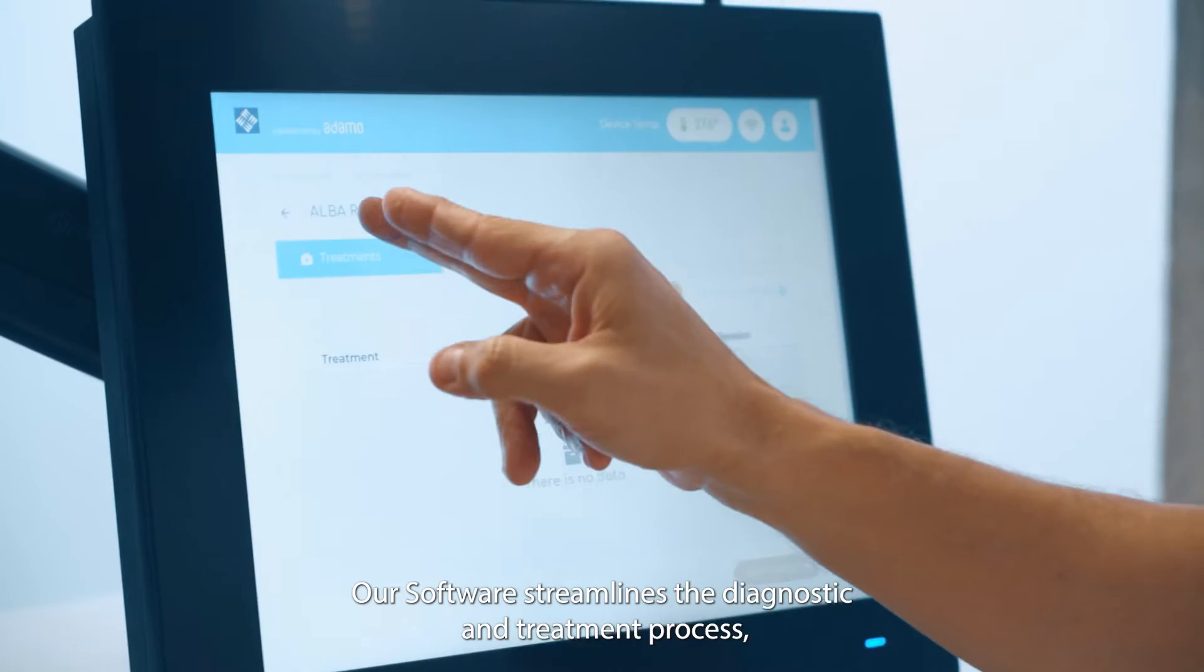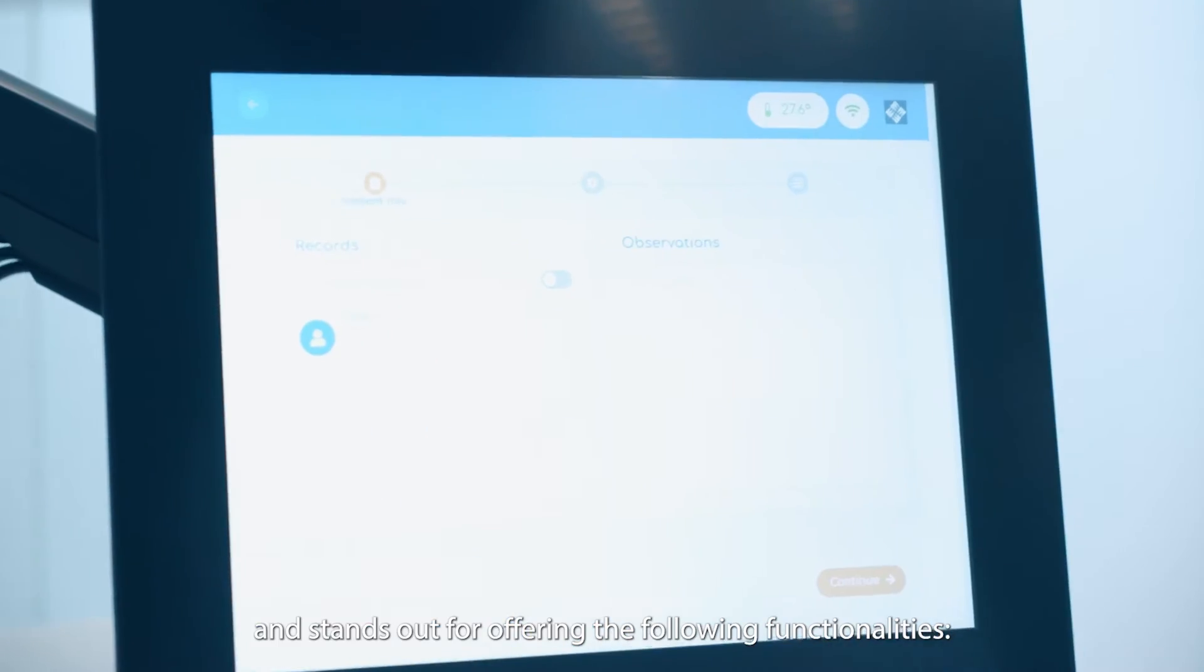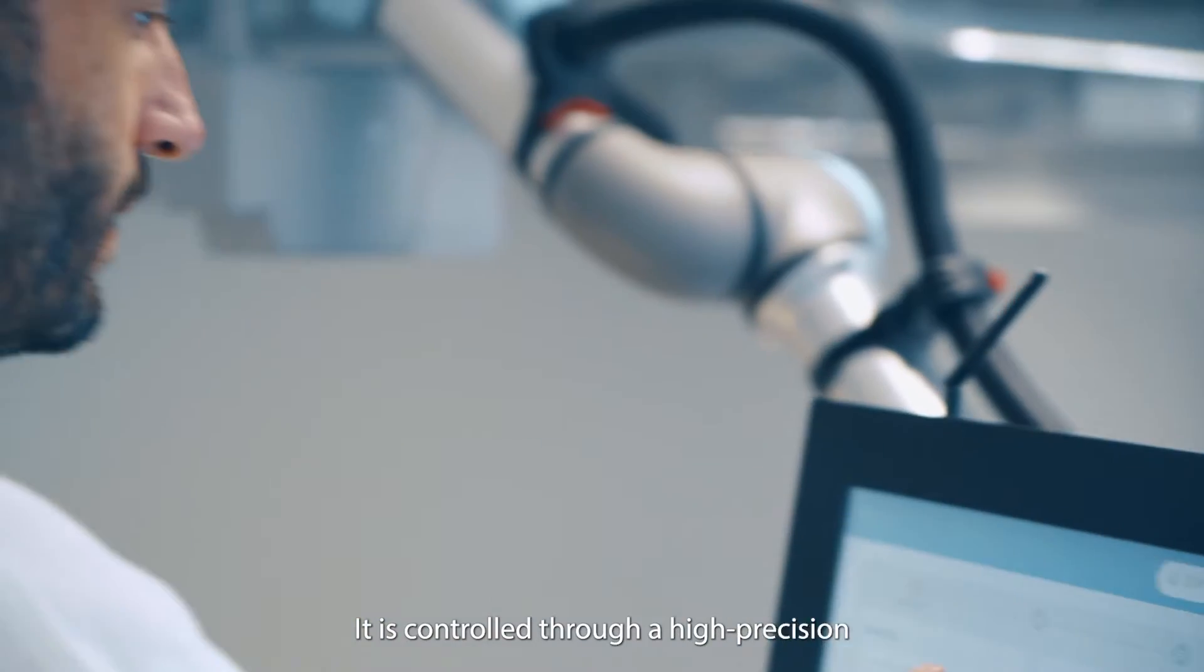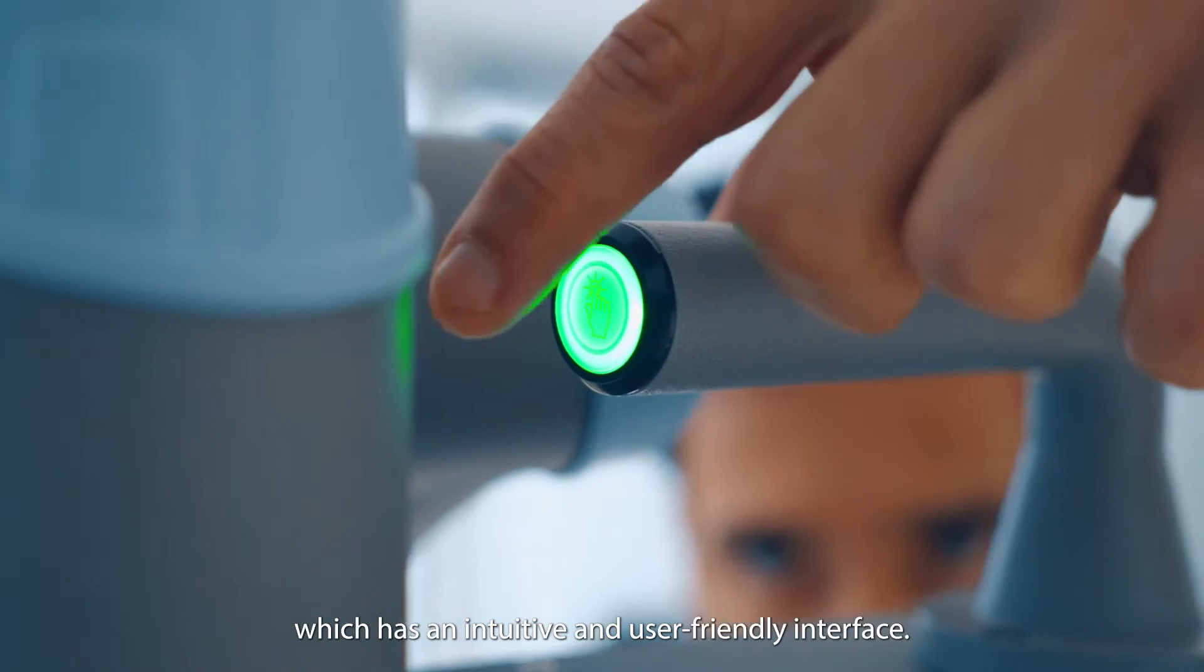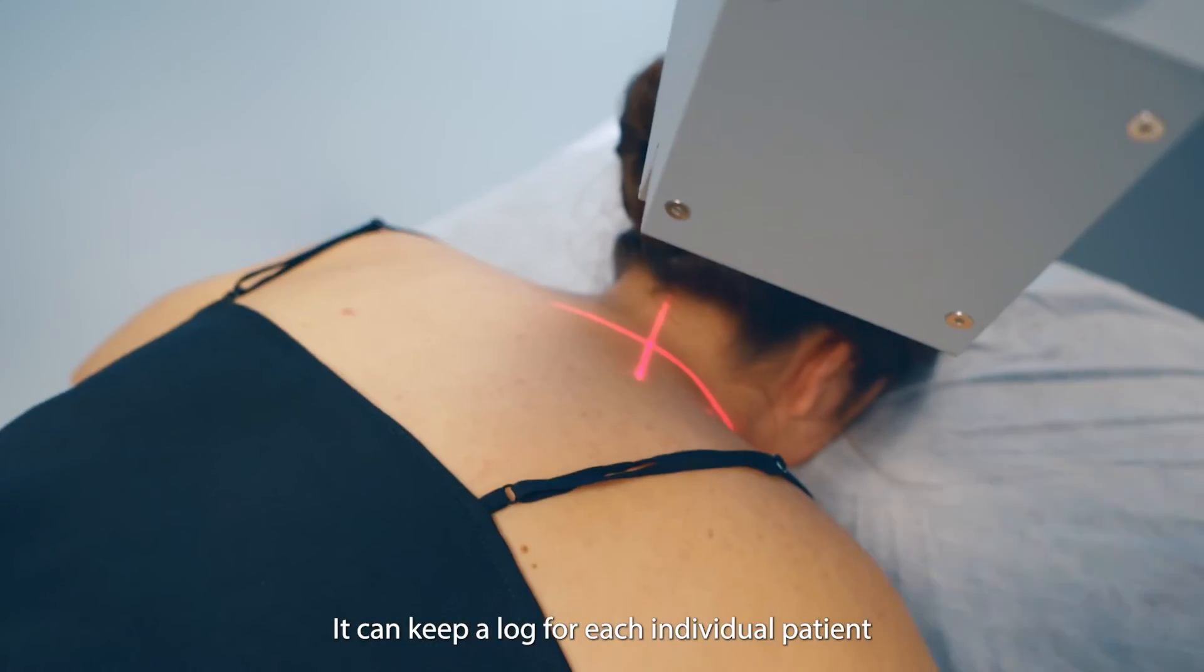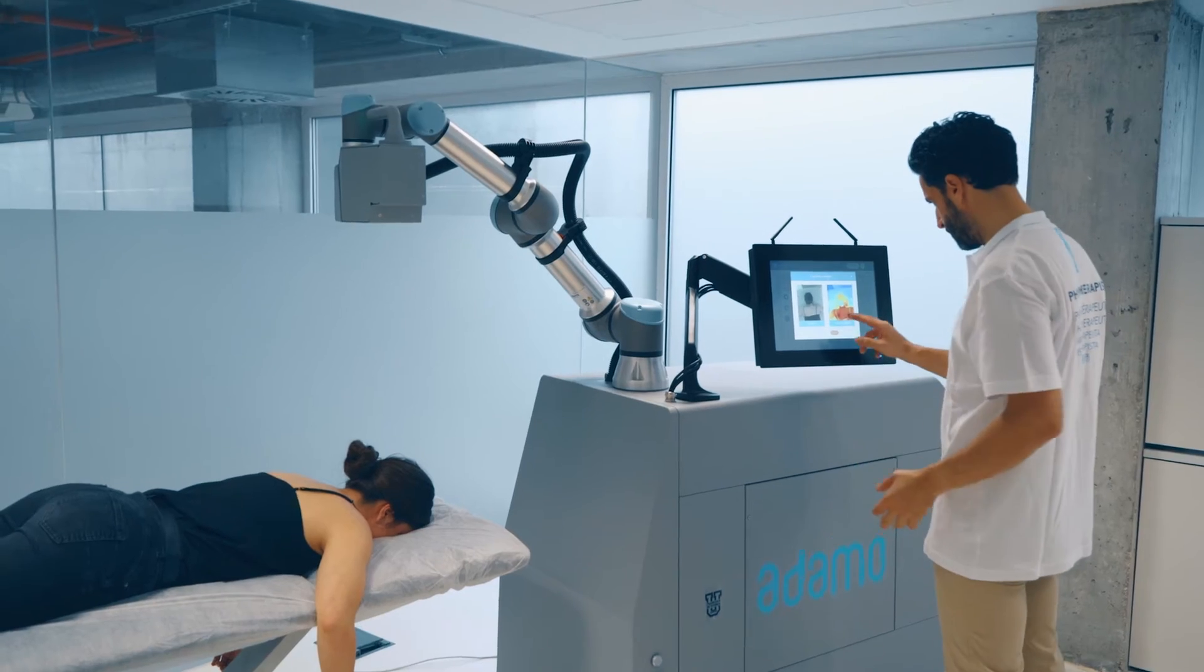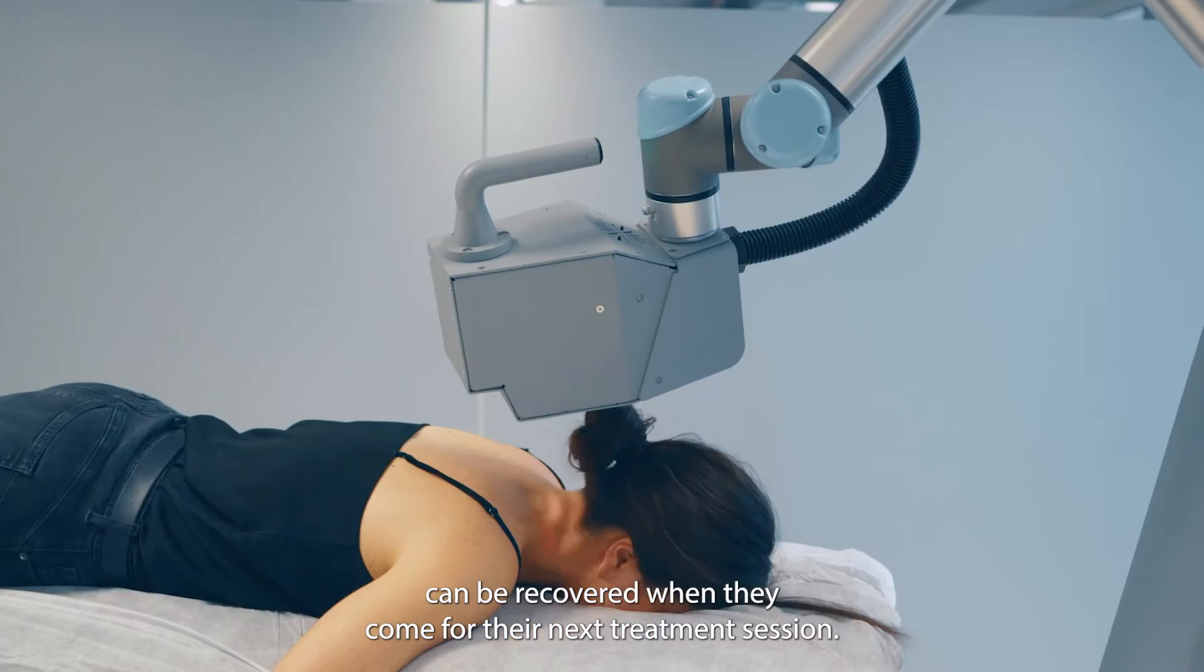Our software streamlines the diagnostic and treatment process and stands out for offering the following functionalities. It is controlled through a high-precision and precision-adaptable touch screen, which has an intuitive and user-friendly interface. It can keep a log for each individual patient that is currently undergoing treatment, meaning each patient's treatment history can be recovered when they come to their next treatment session.